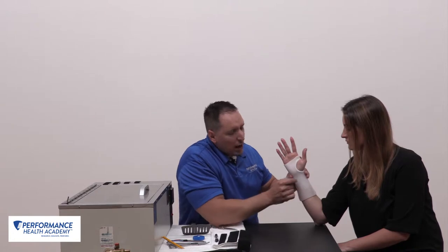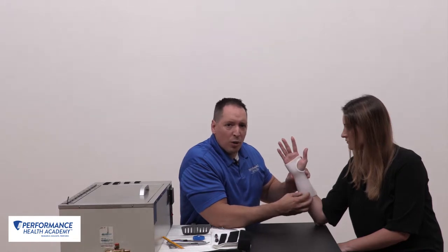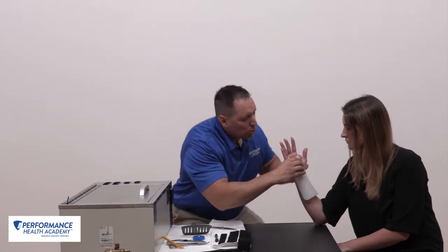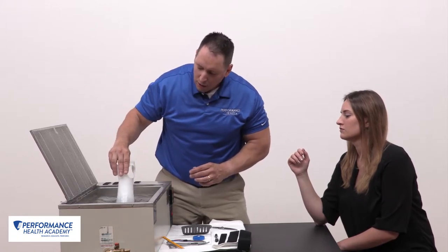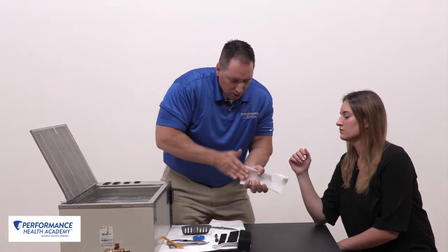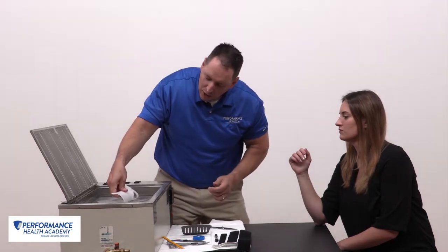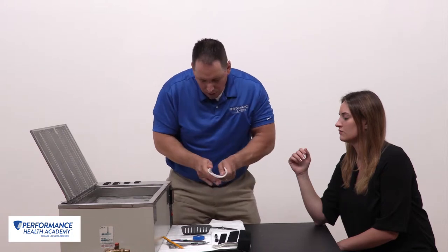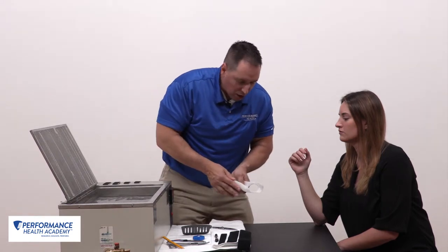Now I'm going to show you how to smooth off your edges and put a little flare at the proximal end of the orthosis. This can be generalized for every orthosis you make. I gently insert the material into the water, move it back and forth, apply a little flare to the bottom, and do the same with all the edges. I run my thumb around each edge to smooth them so they won't cause any skin breakdown or pressure areas.